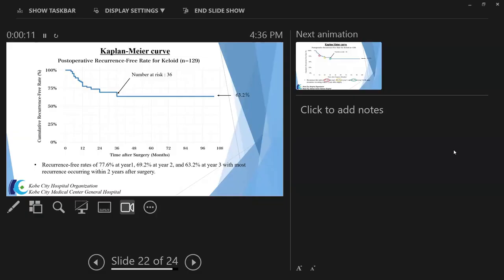What I was trying to say is that in some circumstances the electrons are better, if you've got a long field and you don't want to match fields. In those circumstances, it would be better using electrons. It may be better if there's a big curvature as well. But in other cases, the differences in depth dose are not all that huge for 100 kV at 5 millimeters deep, and that would be most of the work.